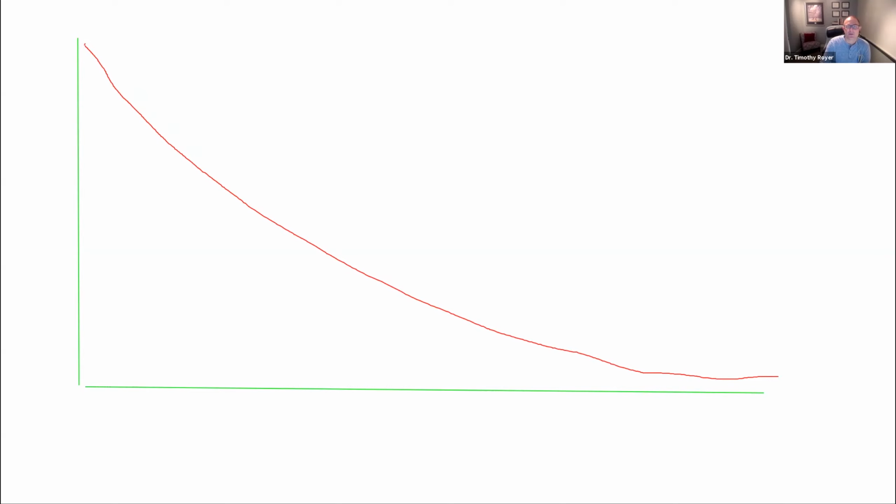We don't spend a lot of time on this one, but this is pretty well documented in the literature: in movement disorders, particularly something like Parkinson's, we have our slow waves, our parasympathetic brain waves, our ideal waves, and our fast waves, our sympathetic ones. But there have been a couple of interesting studies where, for some reason, these 11 to 13 hertz, very specific, bottom out, like they almost become non-existent.